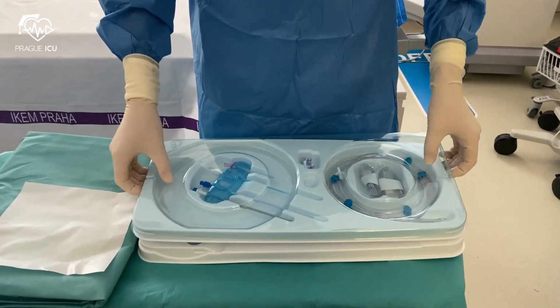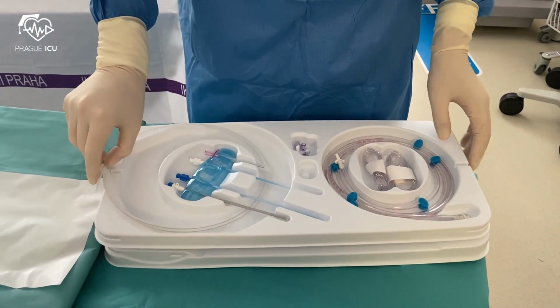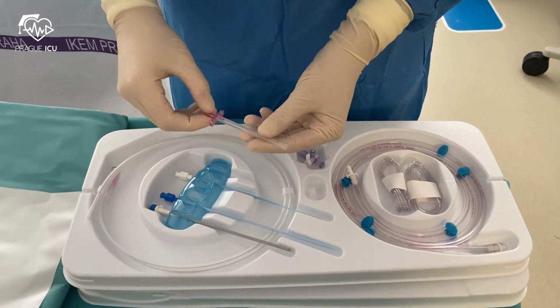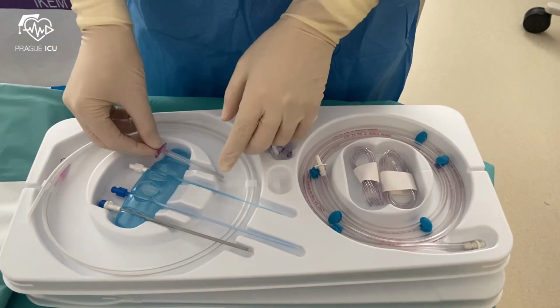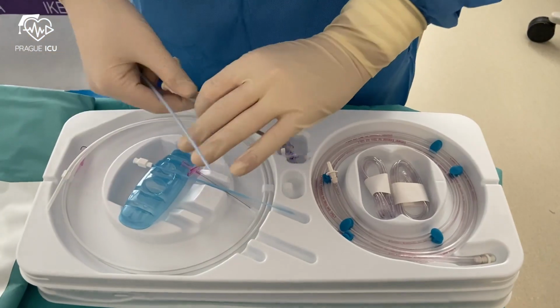The insertion tray contains tools for percutaneous insertion: guide wire, 18-gauge insertion needle, tissue dilator, and sheath.